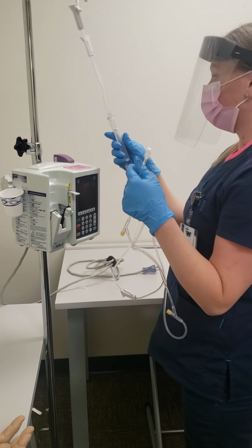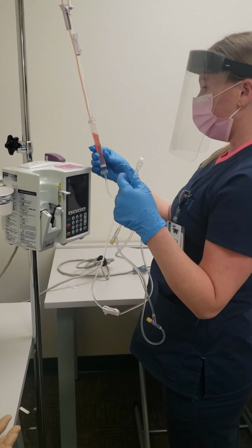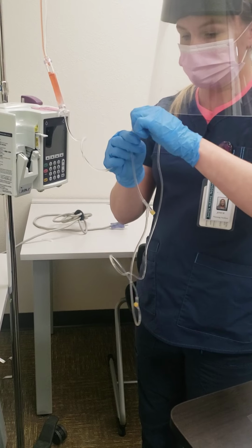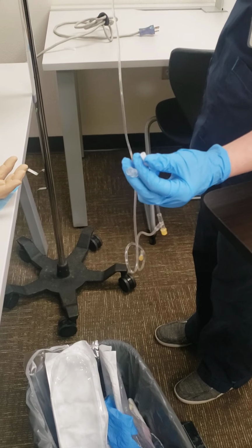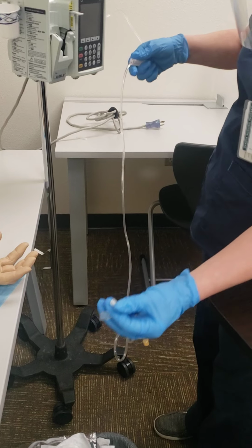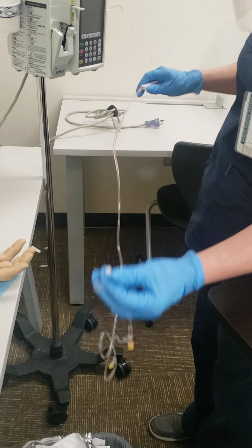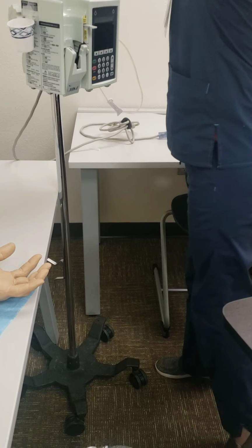And I want to make sure to fill the drip chamber up above the level of that filter when you're administering blood. Okay. And now I will just open this one, making sure to keep this clean so I can recap. And I also want to be sure that I don't waste any of the blood products, so I'm going to do this really slow and go ahead and prime that tubing. Okay. And now I will put a cap on this just so that I can clean the site before I administer it.